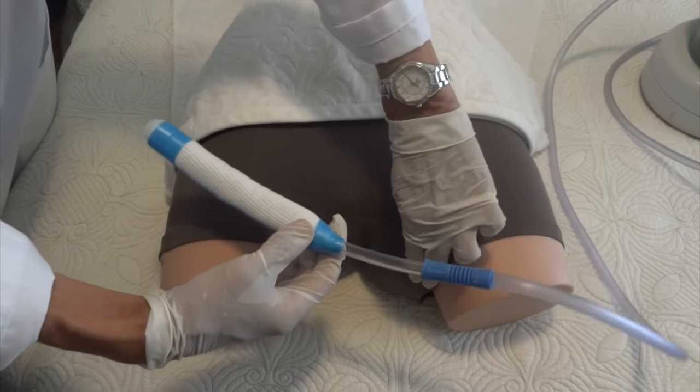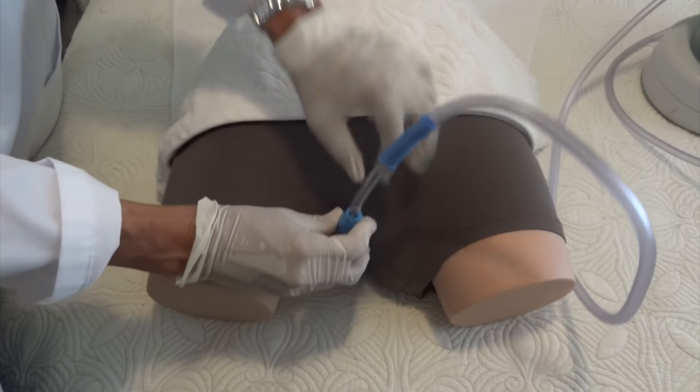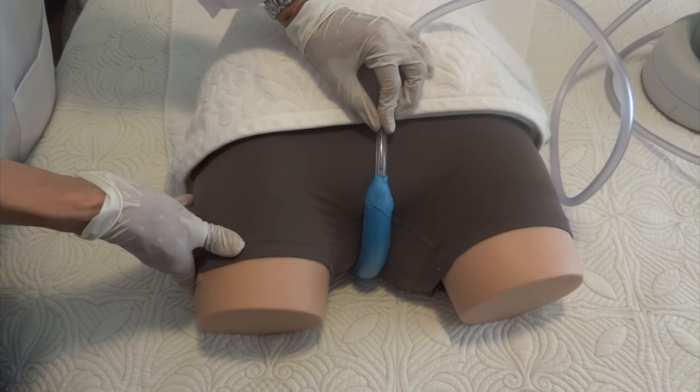Before placing the wick, you want to separate the legs, the gluteus, and the labia, and then let the body go back together. The body will hold the wick in place.